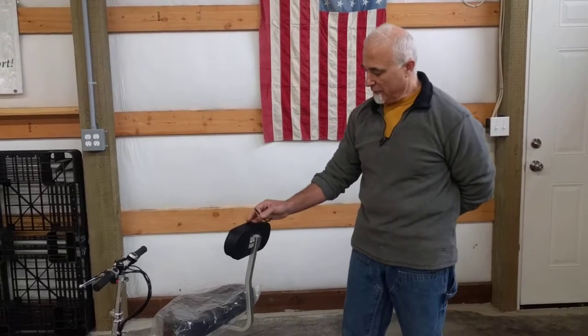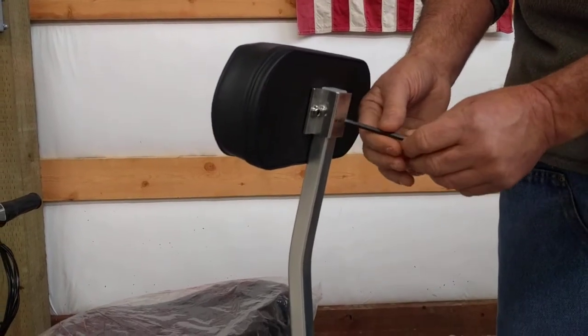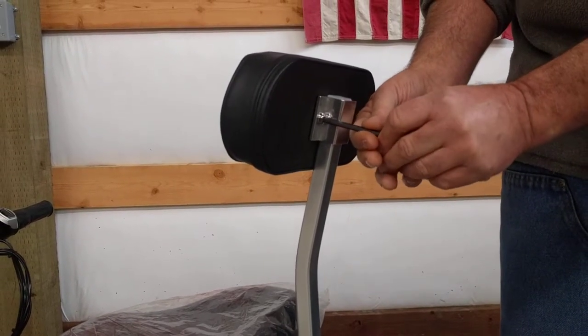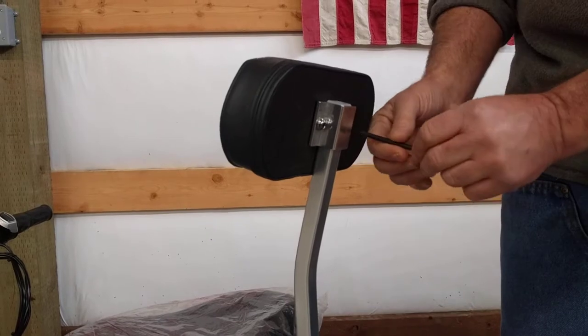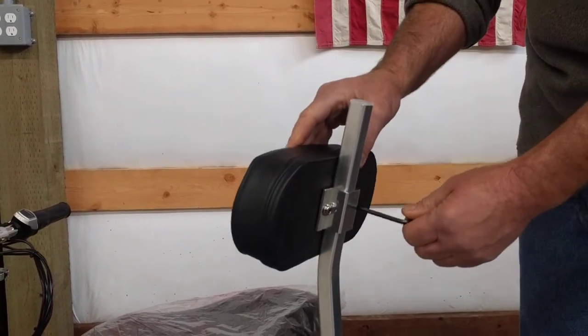This is very simple to do. The backrest is a cushion with a bracket on the back with two bolts. All you've got to do is take the largest allen wrench in your tool kit, loosen the bolts, slide your backrest to the desired height.